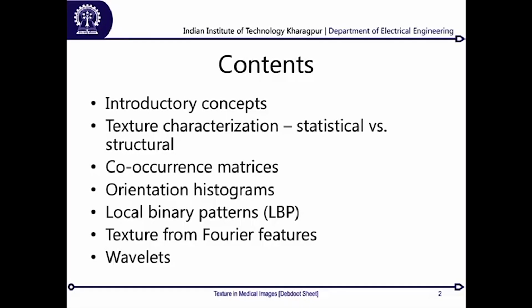So, without much of a delay, let us start with it. First I will be introducing you to the concepts of what textures are, and try to at least elucidate the difference between texture, which is quite a local phenomenon dependent on the image appearance model itself, versus what is noise, which is also a local disturbance, but is not dependent on the image parameters, and is more a function of the imaging instrument itself.